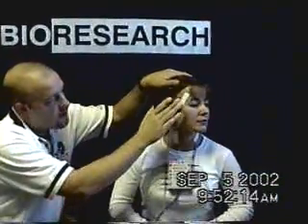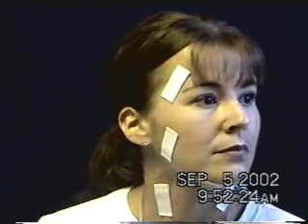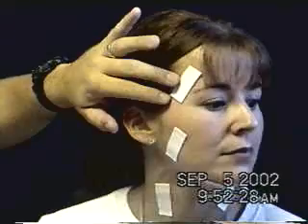The temporalis fans out over the head and is set up with the electrode here. For electrode placement, you have to be careful not to put the electrode over hair. So we've placed the temporalis electrode between the eyebrow and the hairline.